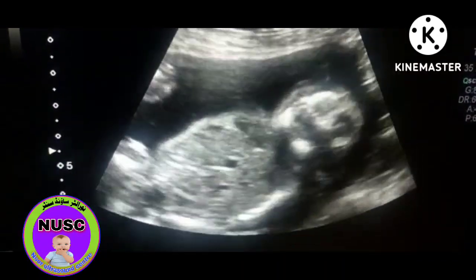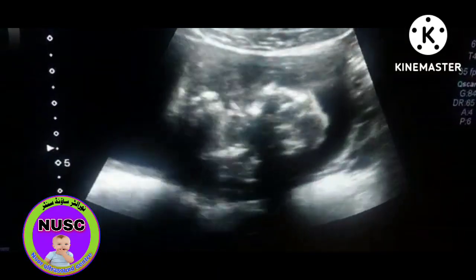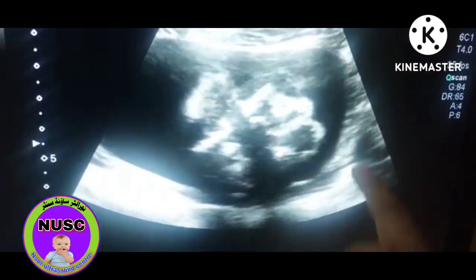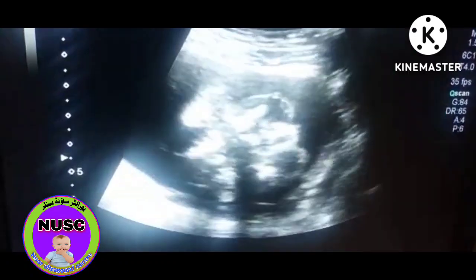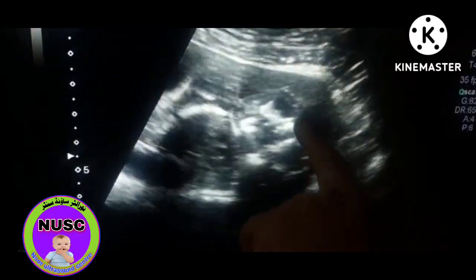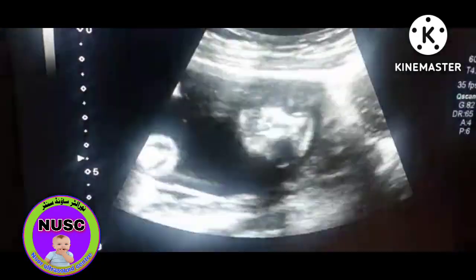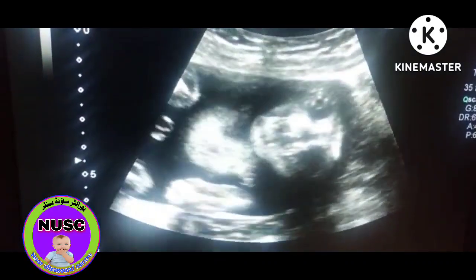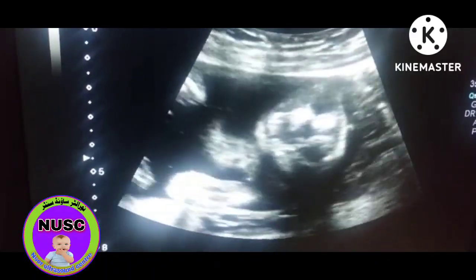As you see here, this is the eyeball, this is another eyeball — no head above. Very prominent eyes. This is the eye, this is the eye. This is the face. This is called frog face appearance.